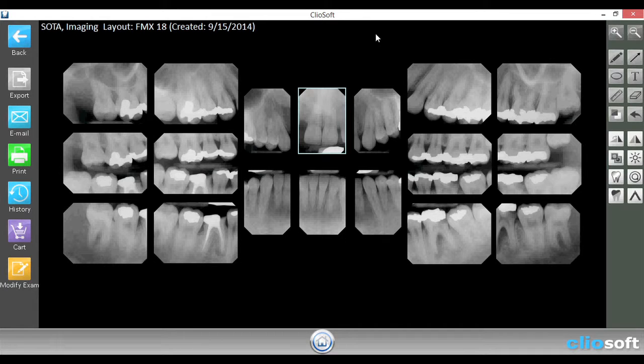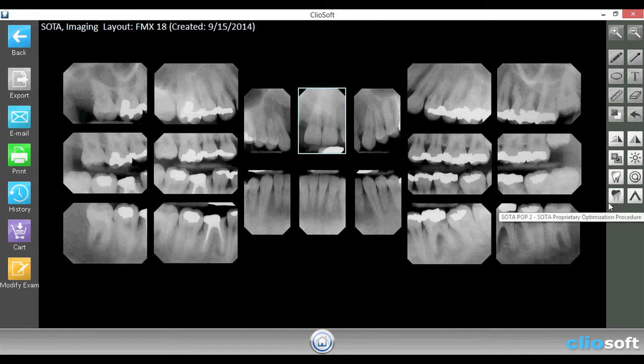On the right side of the exam is where we can edit the image. We have options to zoom in, zoom out, apply annotations, or apply filters.